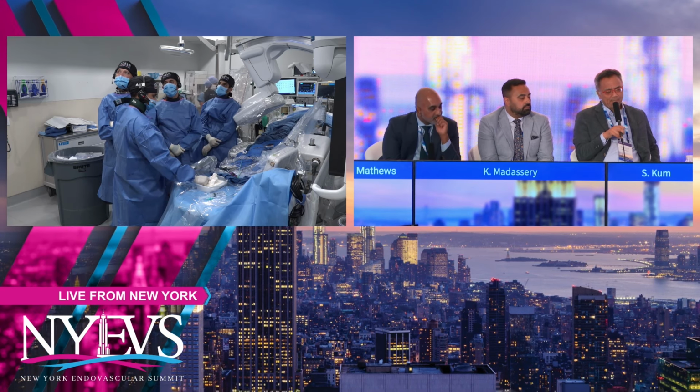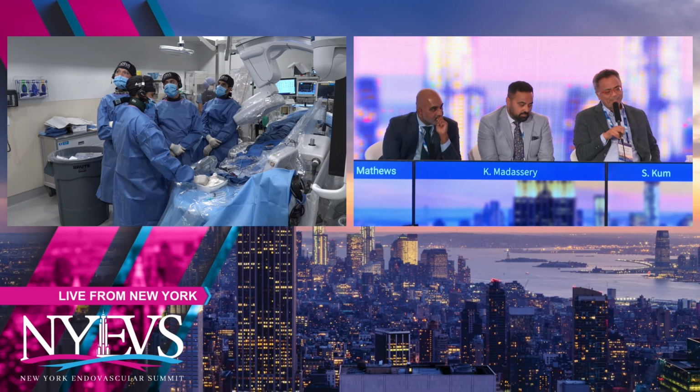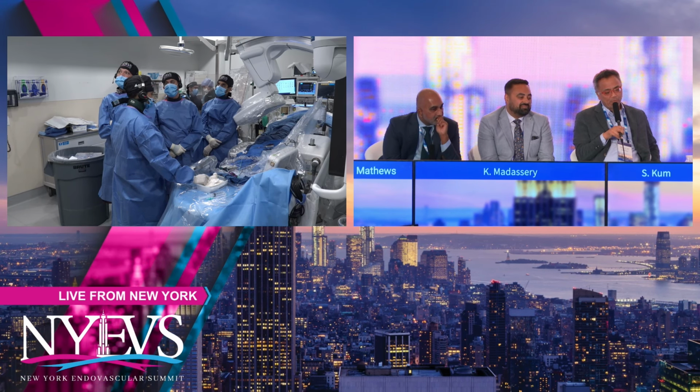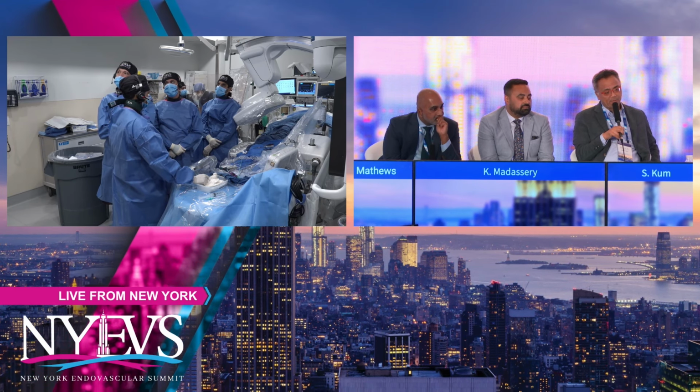And I'm still a little bit uncomfortable with the separation of the stent. Maybe with an Eluvia or with a Zilver right now, we've taken away that issue.